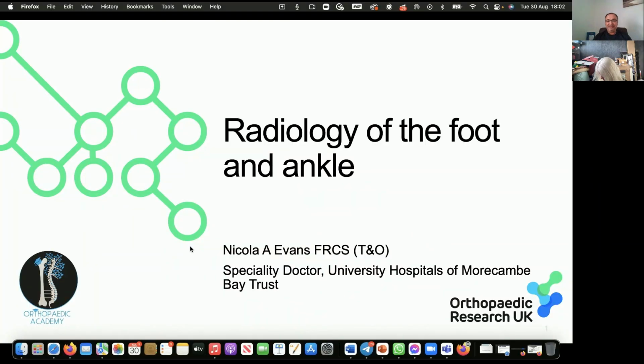Good evening, everyone. Welcome to this evening of orthopedic teaching. This session today is about radiology of the foot and ankle. It's part of our orthopedic X-ray interpretation course that we delivered on the 20th of August, and this is just a continuation of the course with an add-on lecture.